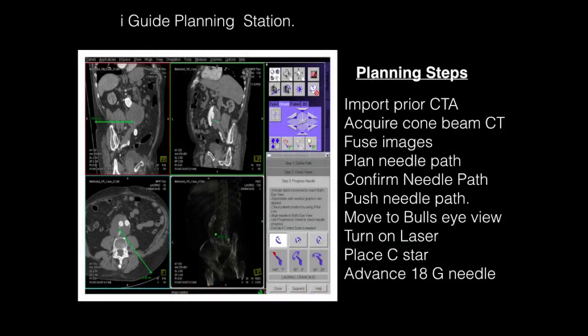This shows the interface in the iGUIDE planning station used to develop a needle guidance path, shown in green in the lower left panel. The planning steps include importing a previously obtained CTA, acquisition of cone beam CT in the hybrid room, fusion of these two images together on the workstation, then planning the needle path, confirming that needle path, and pushing it onto the live fluoro system. We then create what's called the bullseye view, which is used to target where the needle will be inserted in the patient.